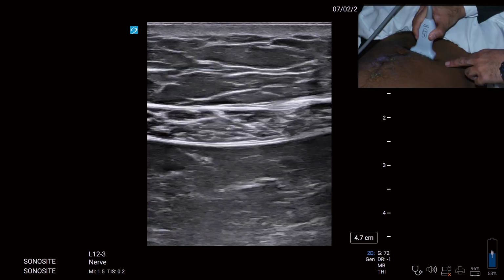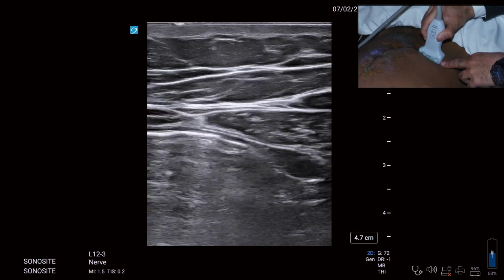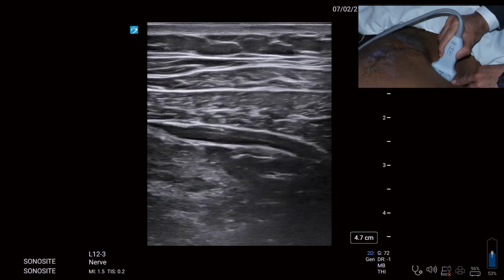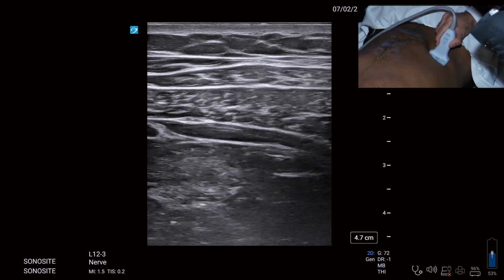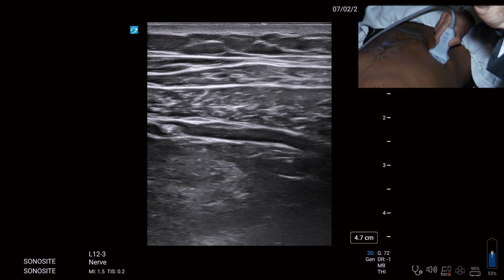Or alternatively, if there are a lot of dressings, I can move laterally, linea semilunaris. I can see 3 muscles, external oblique, internal and transversus. Between internal and transversus, I can do the so-called older version of anterior TAP, which would again take care of the anterior cutaneous branches. Is this concept clear?